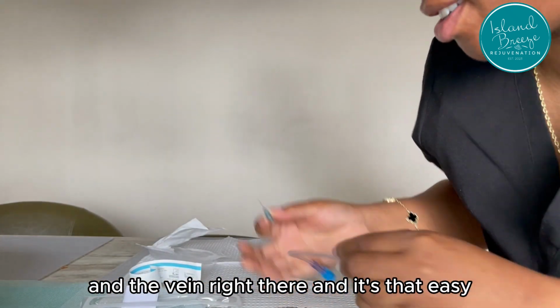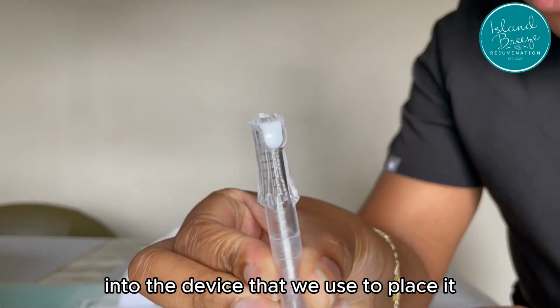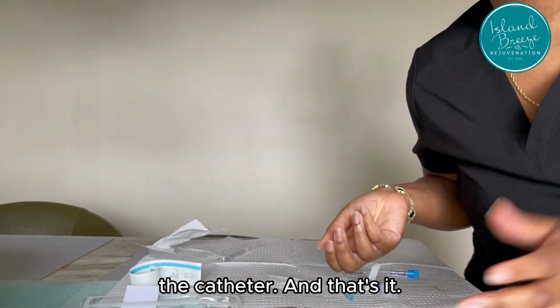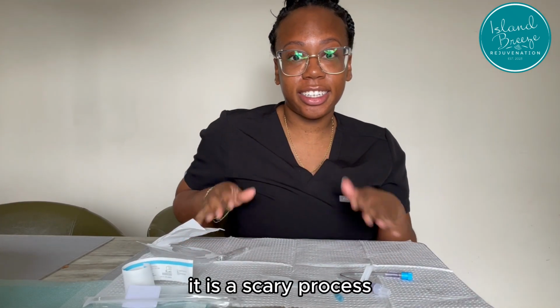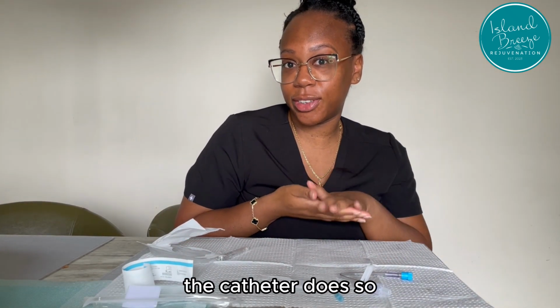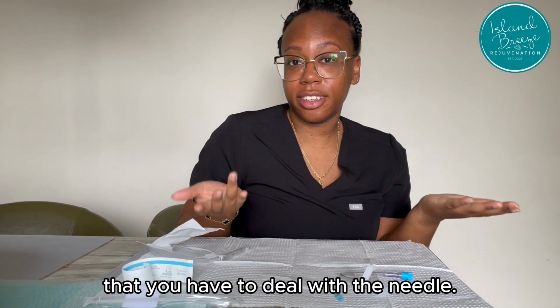And it's that easy. The needle has been retracted into the device that we use to place the catheter. And that's it. So there you have it. For those who are scared of needles, it is a scary process, but the needle does not stay in your arm. The catheter does, so it's a matter of a few seconds that you have to deal with the needle.